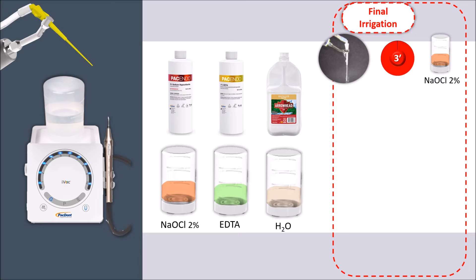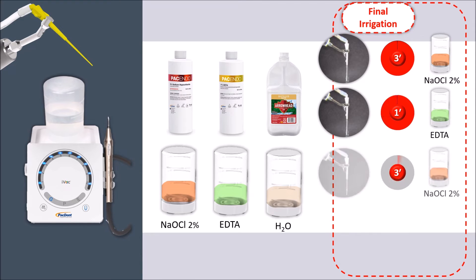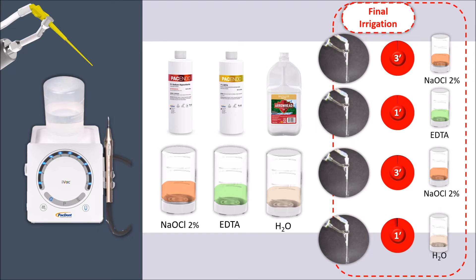Next, change the bottle to EDTA and activate and flush for one minute. Change the bottle to sodium hypochlorite and activate and flush for three minutes. Finally, change the bottle to distilled water, activate and flush for one minute.